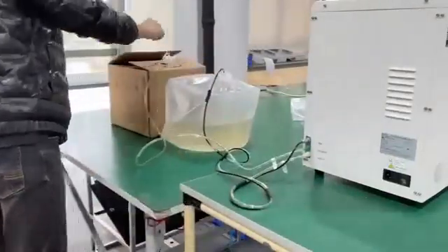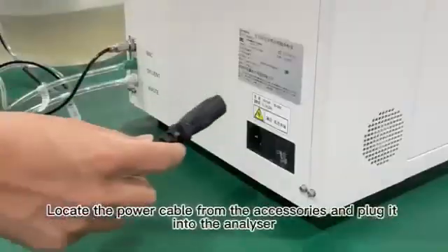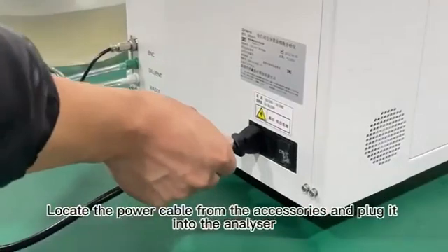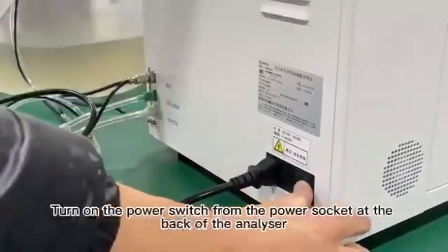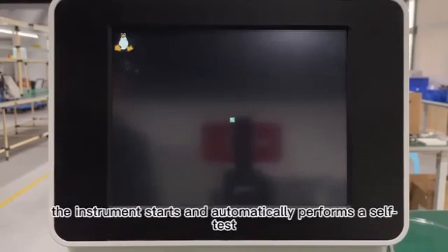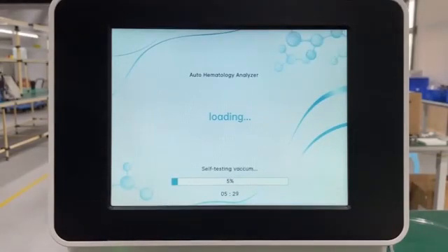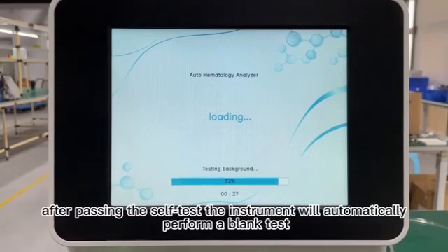15. Locate the power cable from the accessories and plug it into the analyzer. 16. Turn on the power switch from the power socket at the back of the analyzer. The instrument starts and automatically performs a self-test. After passing the self-test, the instrument will automatically perform a blank test.